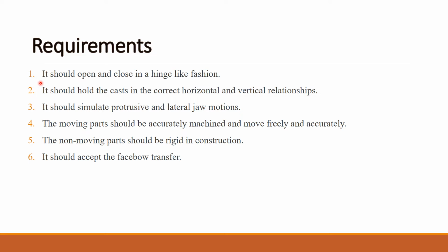So coming to the requirements, it should open and close in a hinge-like fashion. Hinge-like fashion means basically opening and closing of the mouth. It should hold the cast in the correct horizontal and vertical relation. So once we get the relation, we should be able to mount it in the exact measurement and location of how it is placed in the mouth. It should simulate the protrusive and the lateral movement, so the forward and the lateral left to right movements can also be simulated.